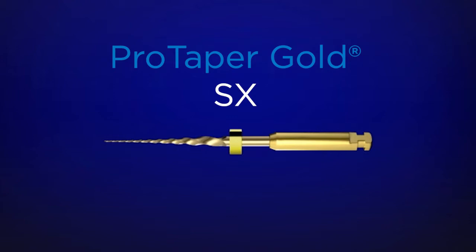ProTaper Gold ShaperX. It's the auxiliary shaper from the ProTaper Gold family of instruments. Notice it looks a little bit short to your eye, and it is. It's short so it can be introduced into narrow interocclusal space.